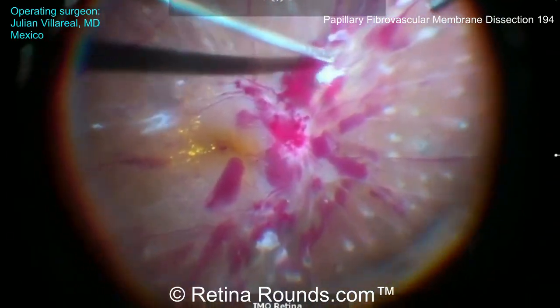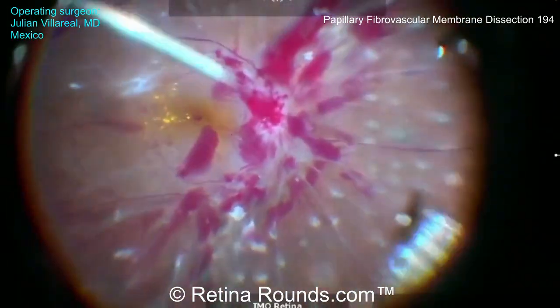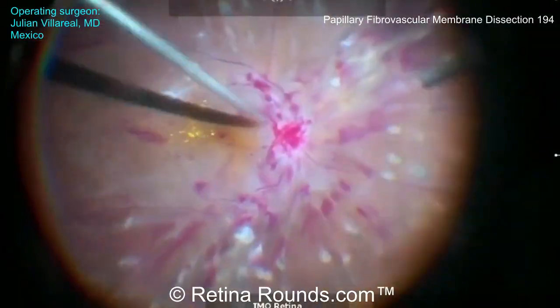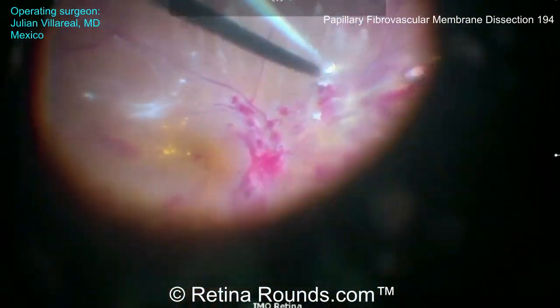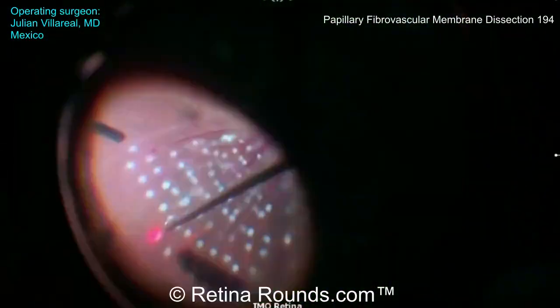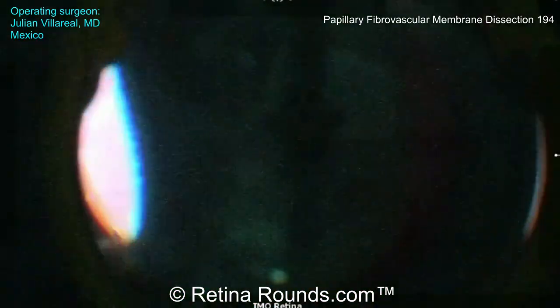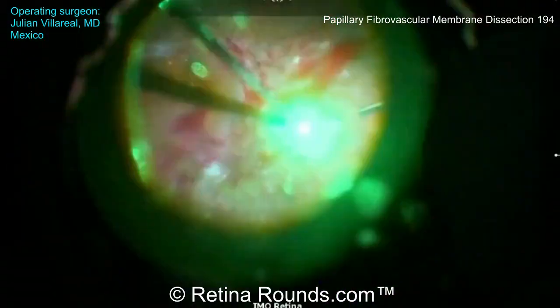After the delamination is completed, the soft tip is used to clear any residual blood. Lowering the infusion pressure to about 10 to 15 millimeters of mercury can help to identify any residual oozing spots that can be treated with diathermy. Some oozing can occur over the optic nerve, particularly if there is a residual stalk. In this case, the stalk was successfully delaminated using the cutter, but if bleeding were to occur, tamponade pressure could be used temporarily — always weighing pros and cons against the risk of potential retinal or optic nerve ischemia.